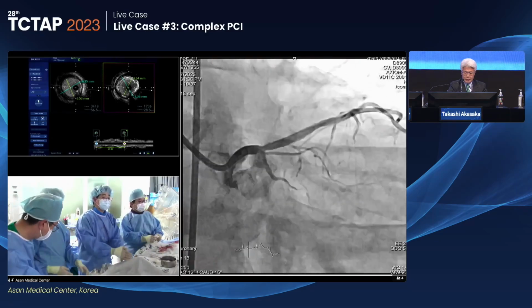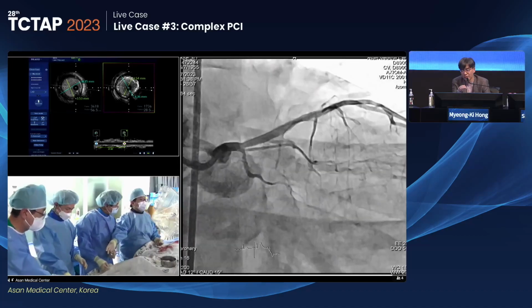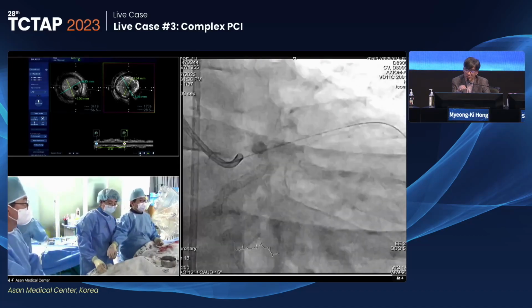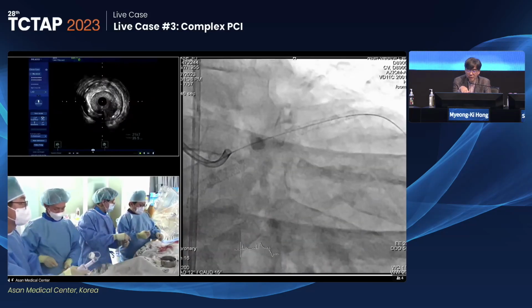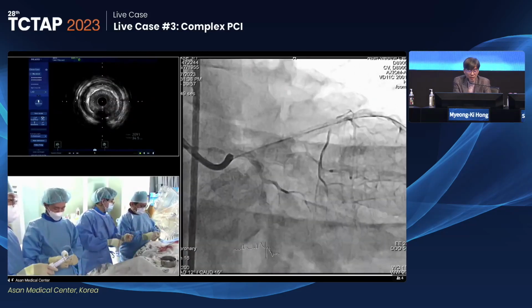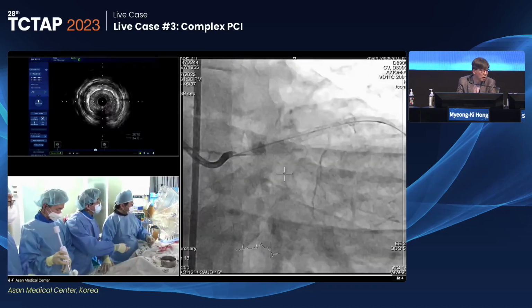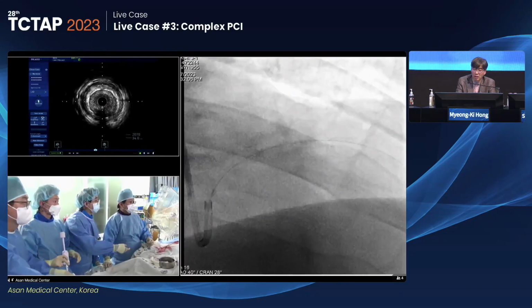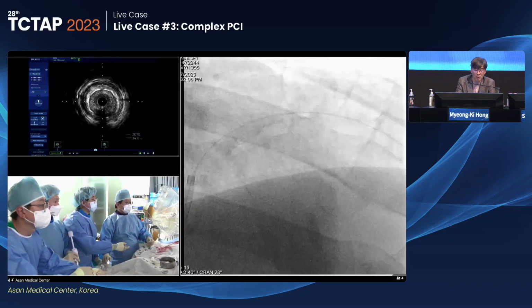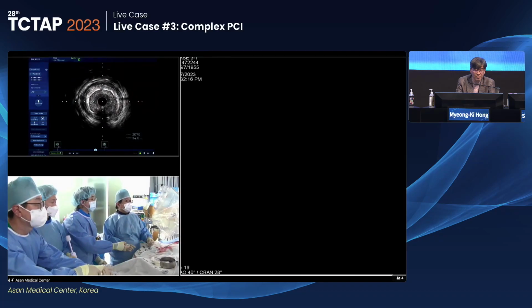A little bit beyond the expectation. What I mean is that after the balloon dilation, I imagined there would be no residual stenosis, but the angiographic appearance is a little bit narrowing. I will get another view also to make sure that we have a more comprehensive assessment. Ready?